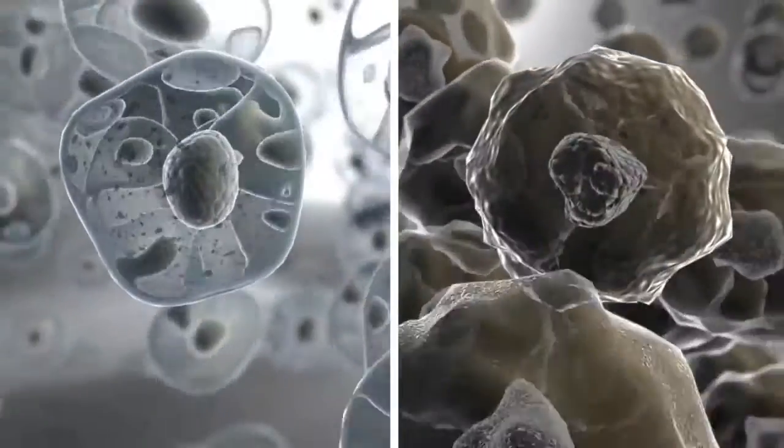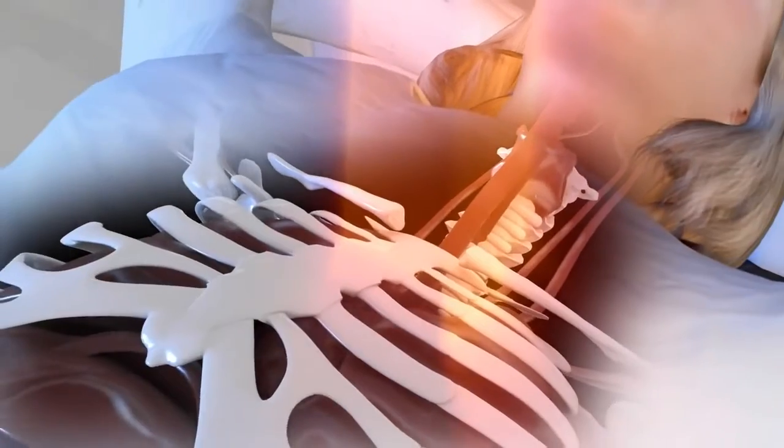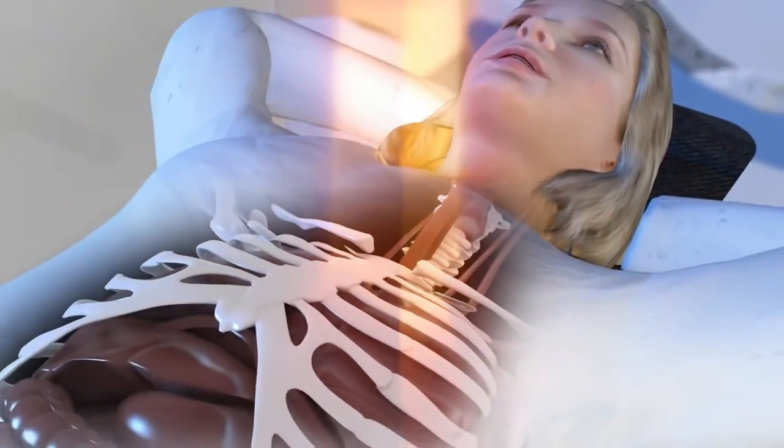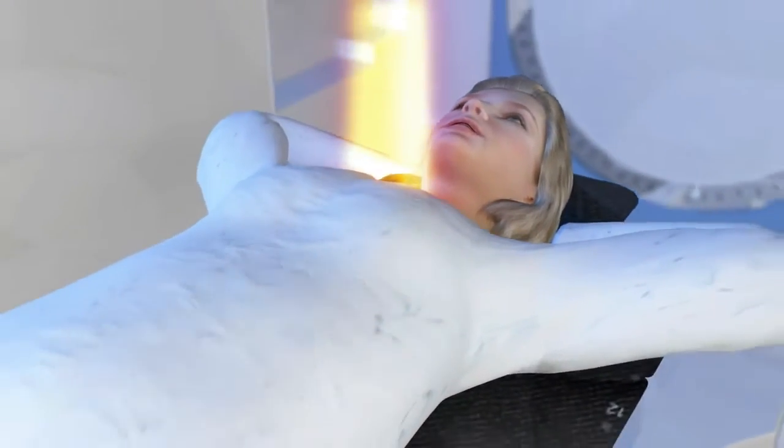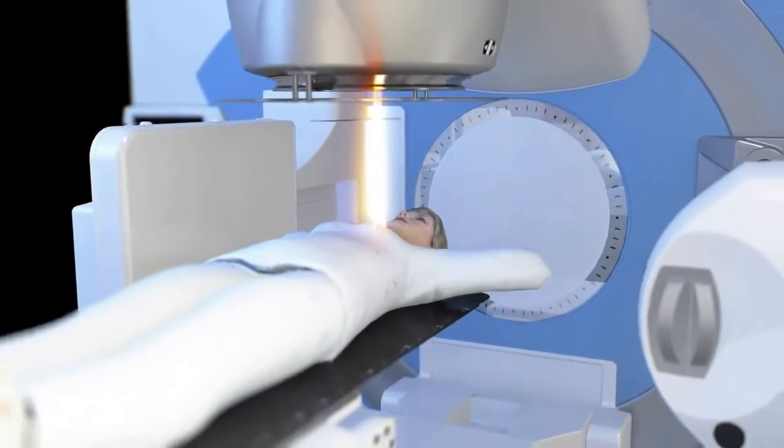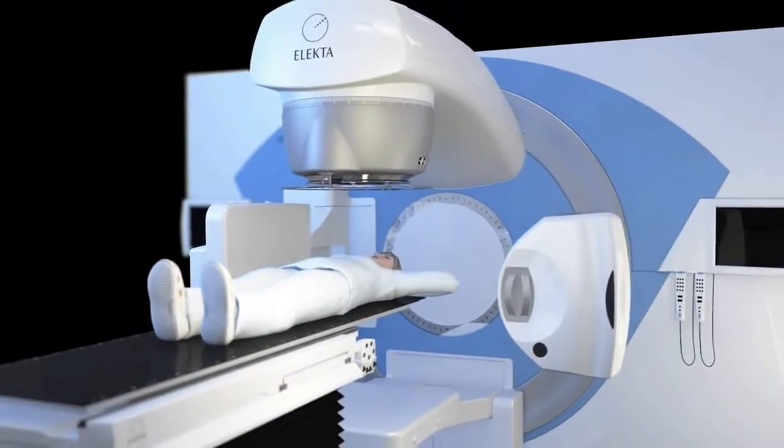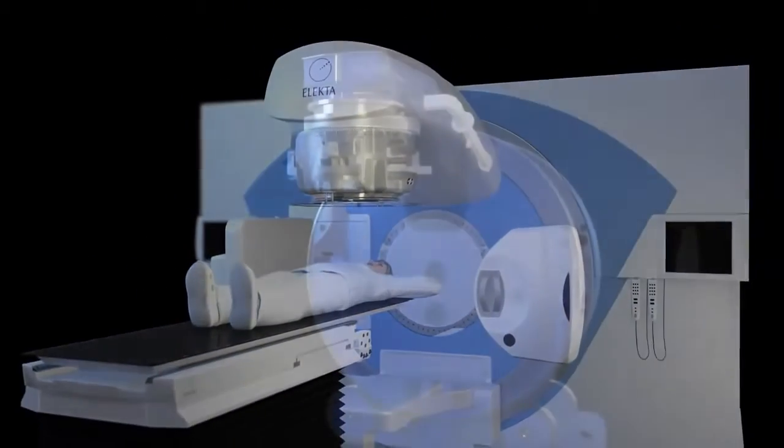Successful radiation therapy depends on the ability of the Linear Accelerator, or LINAC, to deliver a tumercidal dose of radiation to the tumor while ensuring minimal radiation of normal tissue. The LINAC accurately produces, monitors, controls and conforms the radiation beam to the planned target.